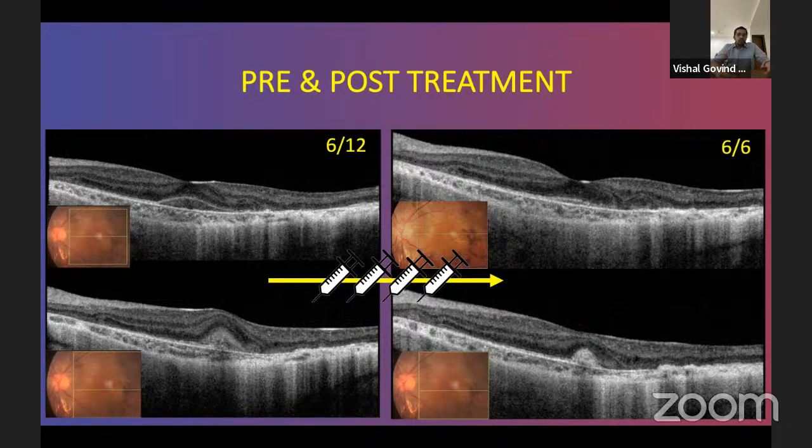And also it's two-dimensional. Whereas OCTA, I totally agree with what Dr. Sharath said, the challenges and the acquisition times are pretty high in OCTA, so it can be very challenging to have them fixed. But if you can get a good image, then you can sit and segment it, and then you can pick up every layer you want, and you will be able to pick up the data which you want to see. So I would certainly say OCTA does score. It is a very niche sort of requirement of OCTA, but yes, it would score in this situation.